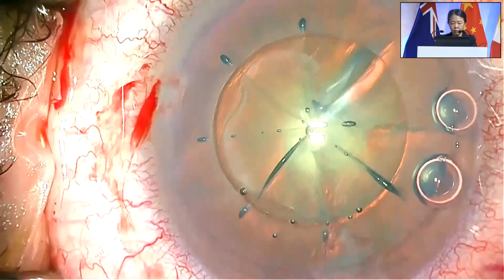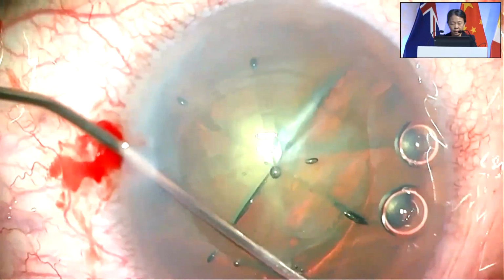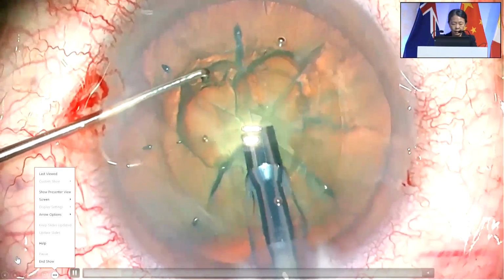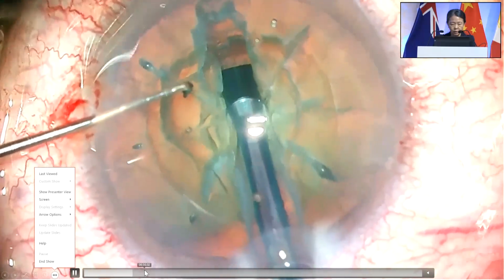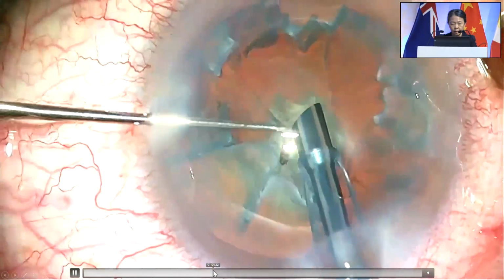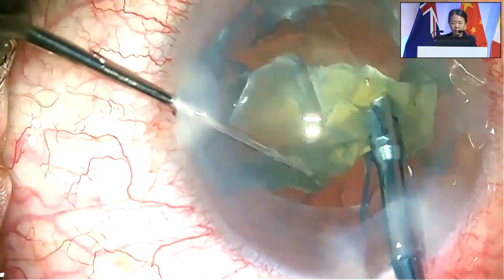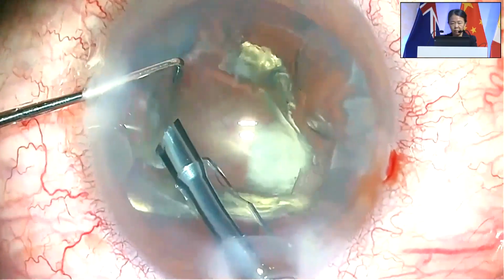So I'm just going to fast forward through this, because it's just how I do a polar cataract that's already pre-ruptured, putting some viscoelastic there under the anterior capsule, and then doing the phaco in my standard polar cataract technique. So I just do a cross chop, and then towards the end, we have this epinuclear plate that's still intact over the polar opacity to protect the defect.